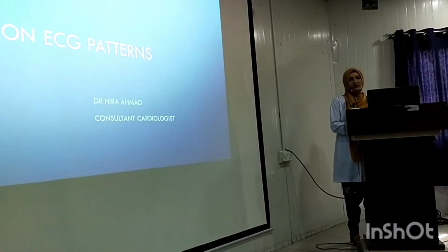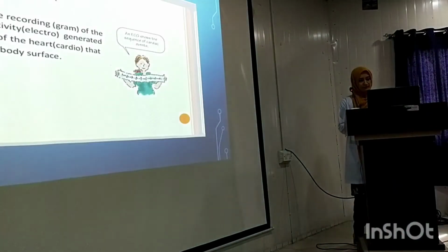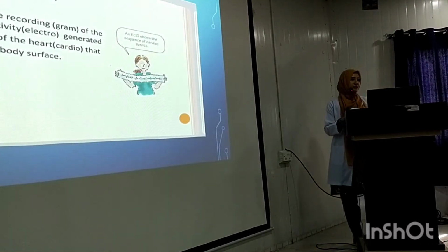We are going to discuss the common ECG patterns today. So let's begin. What's an ECG? In simple words, ECG is the recording of the electrical activity of the heart.